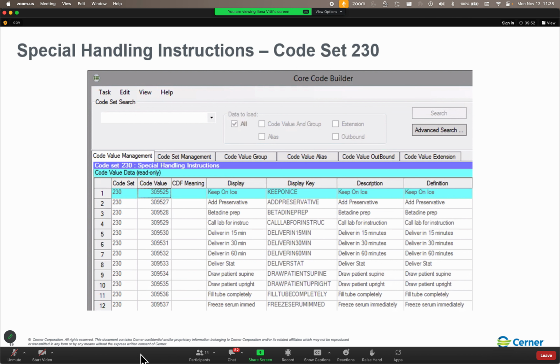And then after the glucose is administered, there's a blood draw maybe at 30 minutes after, and then again at 60 minutes after, and then maybe at 2 hours after, and at 3 hours after. So those blood draws must happen at 30 minutes, 1 hour, 2 hours, 3 hours. They cannot be collected early.